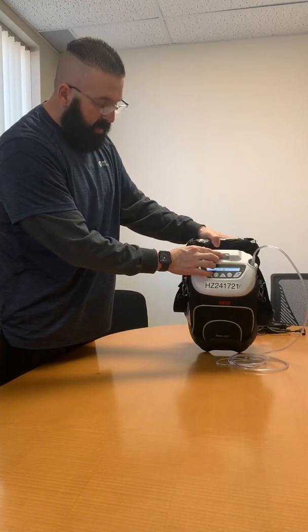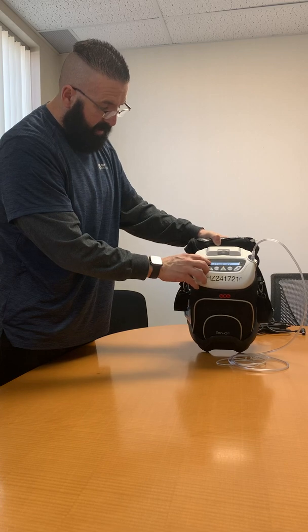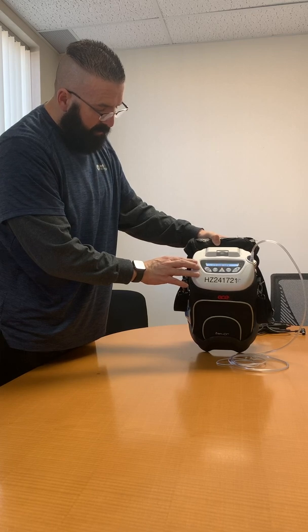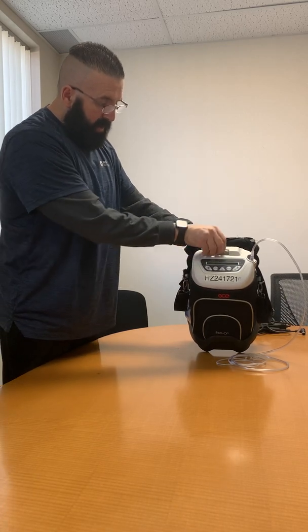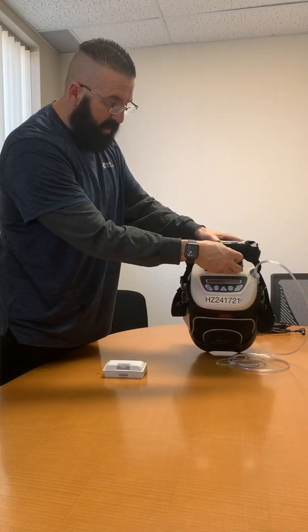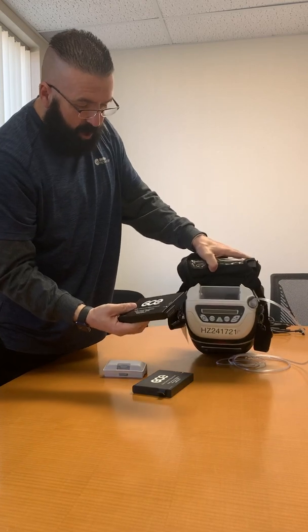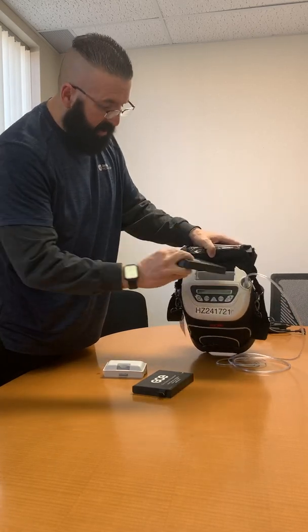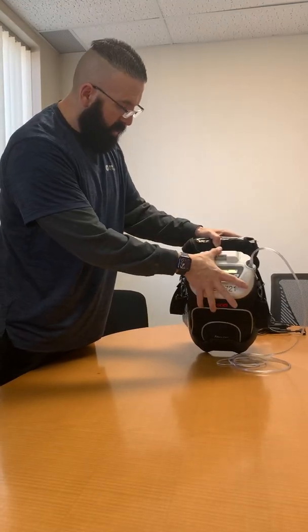Up inside here is where we keep the double batteries. You want to make sure the machine is turned off before you pull the batteries out. So again, we're waiting for it to shut off. Okay, so as you can see right here, you're just going to lift this right up. This comes off. There are two batteries that sit inside here. There is a little black thing that you can use to pull each one of the batteries out. I'm not sure if you can tell, but there's only one way for the battery to go in. If you try to put it in the opposite way, it doesn't fit in. It only goes in the one standard way. And then the top just goes right back on.